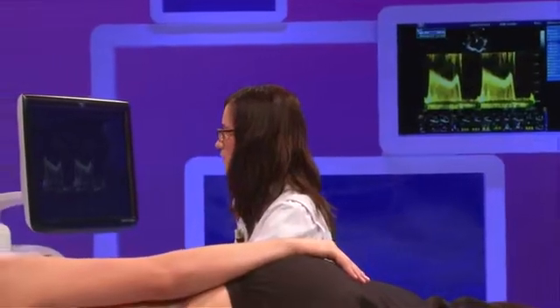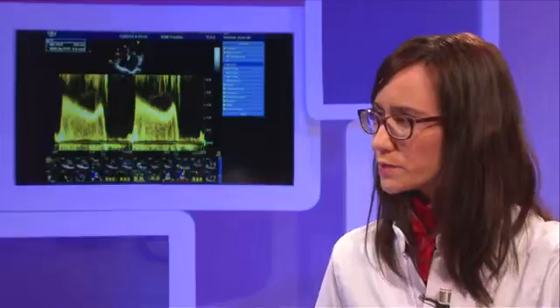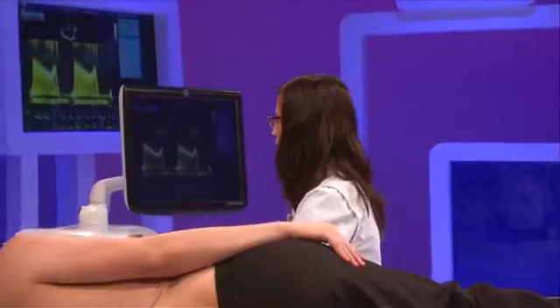This equation was validated. Actually, this is based on the equation validated by Hatle, in which it's a constant 220 divided by the pressure half-time, which gives you the mitral valve area. You don't have to forget the fact that this stands only for mitral valve stenosis and also for native valve, so not on prosthesis to derive the mitral valve area, and neither on pulmonary or another valve.